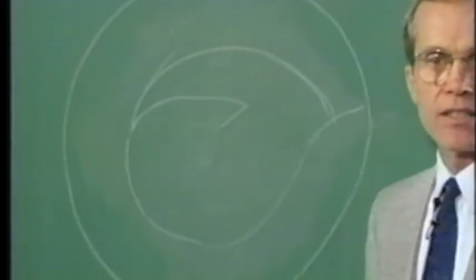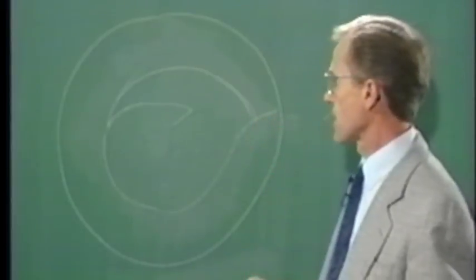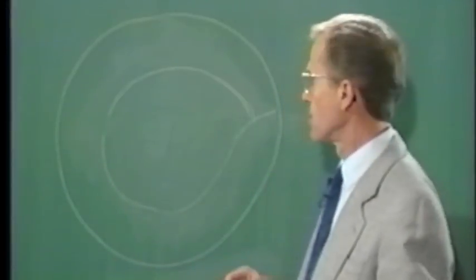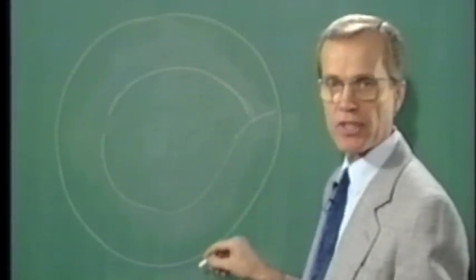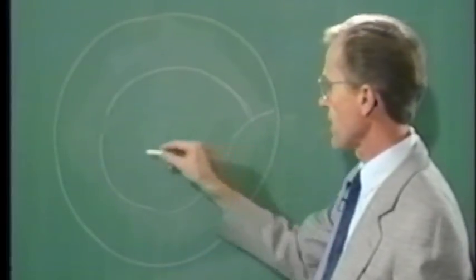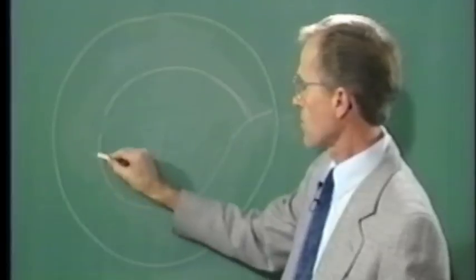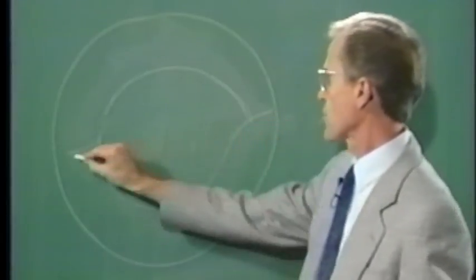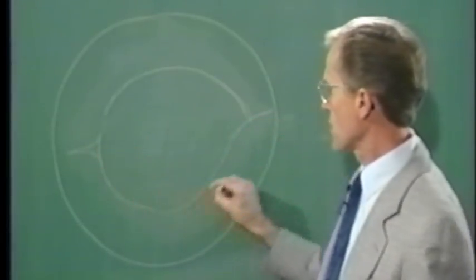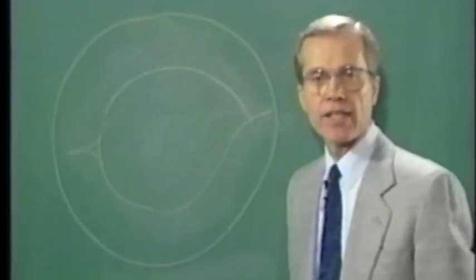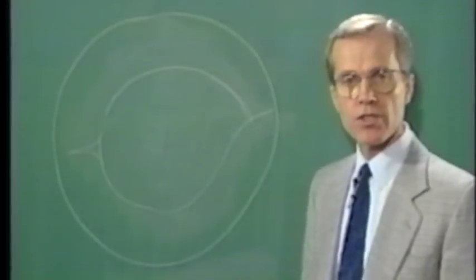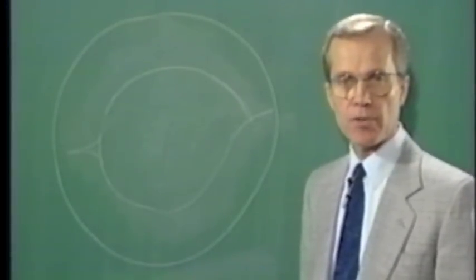That one defect has potential for problems in the late post-operative period. And what I recommend is with any defect in the anterior capsule rim, such as this, once the lens is inserted, I would orient the loops perpendicular to that one tear and then match that tear with a cut with a Vanna Scissor and extension with forceps so that you have matching tears and matching arcs of anterior capsule edge which do contract after surgery so that there is no unequal force to displace the lens in the post-operative period.